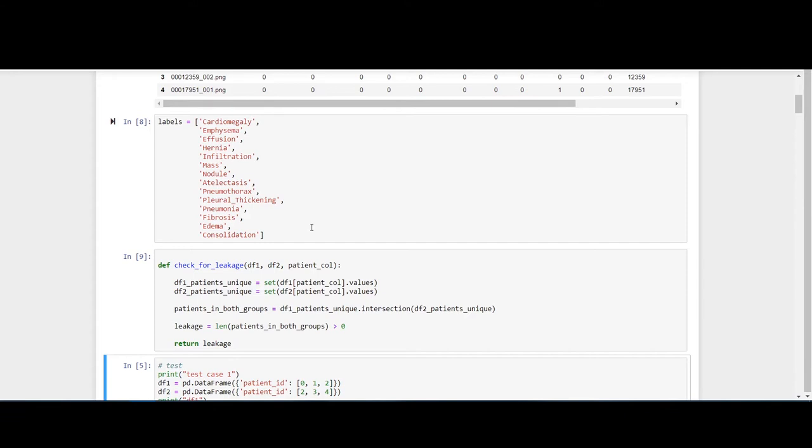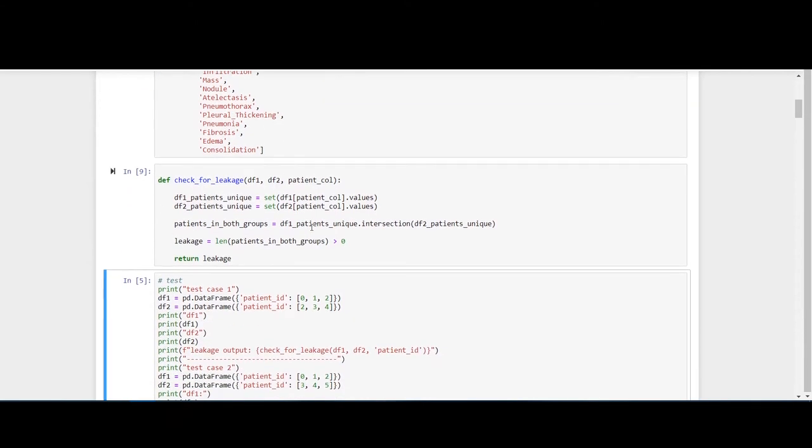When testing accuracy, you will get super optimistic accuracy results. Your model will perform much worse in real life, because the model was trained on one X-ray, and then in the test a similar X-ray was shown to tell whether this person has pneumonia or not. So it will accurately say that this person has pneumonia, and the accuracy will be through the roof. But on a real data set it won't perform that well, and in medicine you need perfect models, you can't have less accurate models.